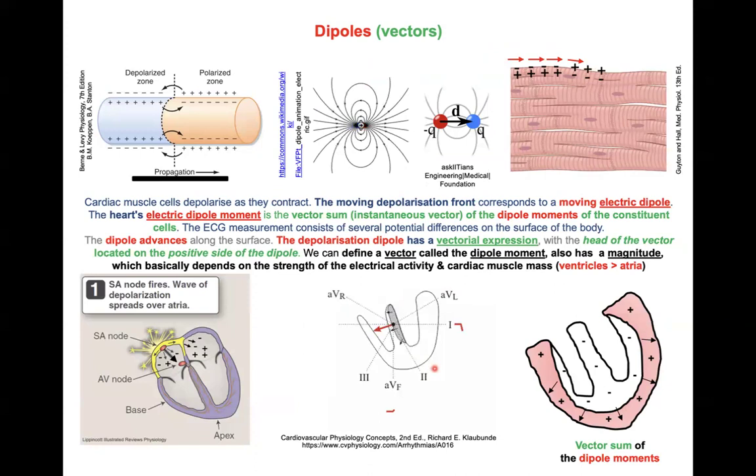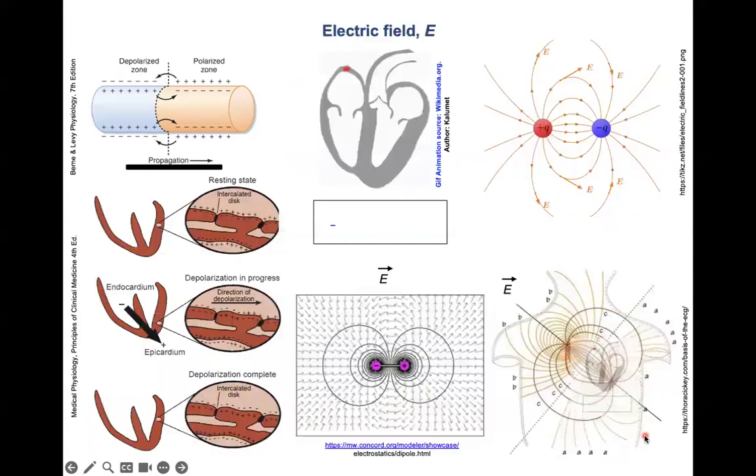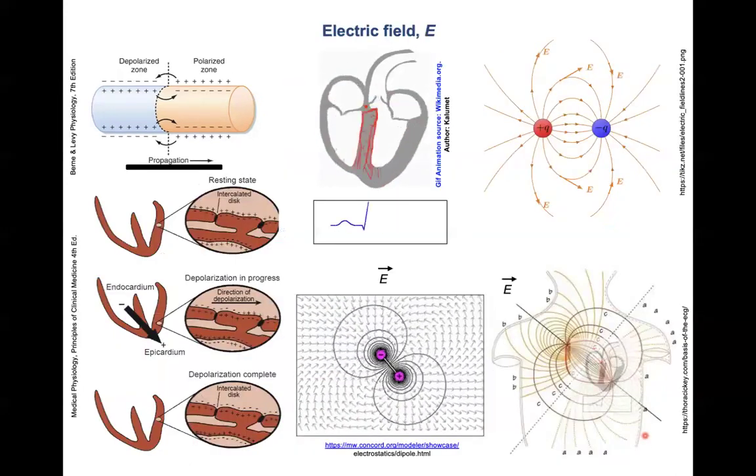The electrical activity that stems from the heart reaches the skin. It becomes weaker on the skin, but it will be amplified using the ECG system. Here we see the example. The mass of the ventricle is much larger than the mass of the atria. The vectors in the ventricles will be stronger in the ECG recording. So now, let's move on to ECG recording step by step.